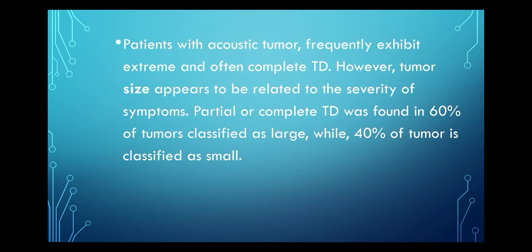Patients with acoustic tumor frequently exhibit extreme and often complete tone decay. However, the tumor size appears to be related to the severity of symptoms. Partial or complete tone decay was found in 60% of tumors classified as large, whereas 40% of tumors are classified as small.